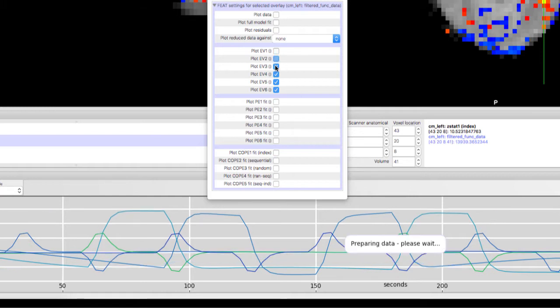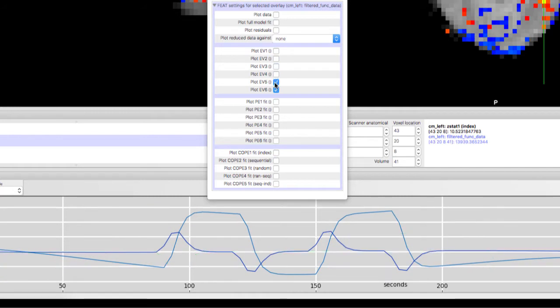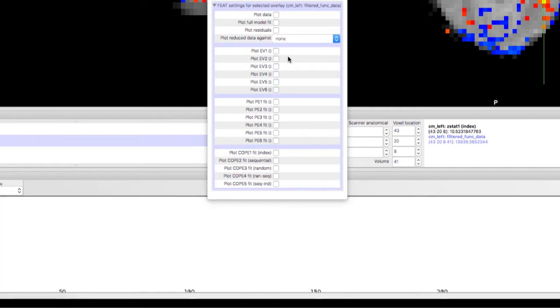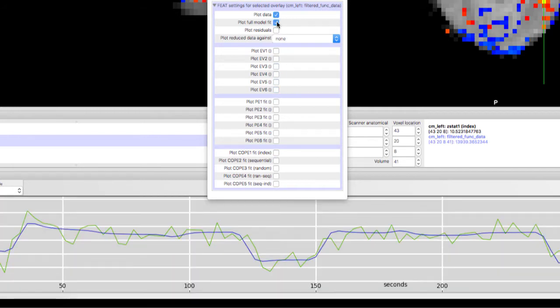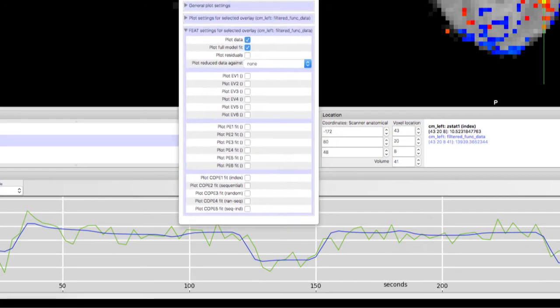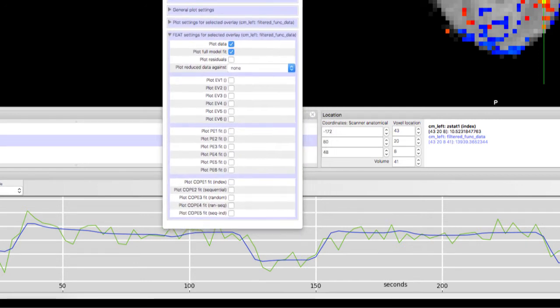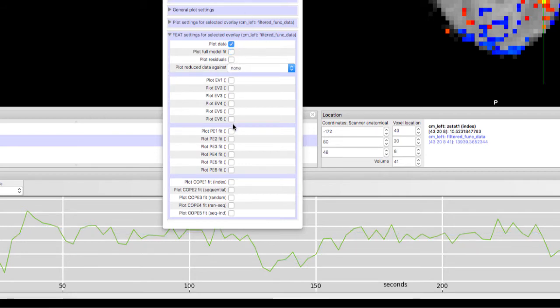Now remove those EVs and plot the data and model fit. A significant Z-statistic means the model fits the data well. You can analyze the full model fit by looking at each regressor fit separately. Remember that all the regressors are scaled simultaneously to produce the best model fit.